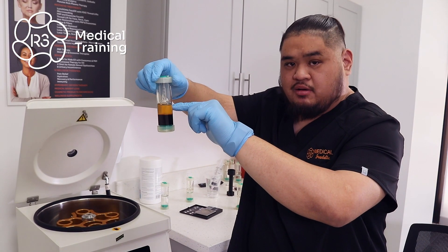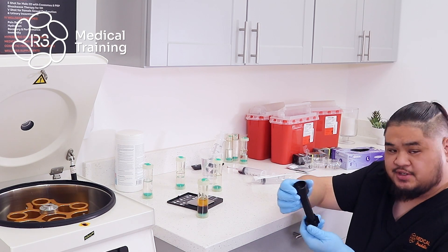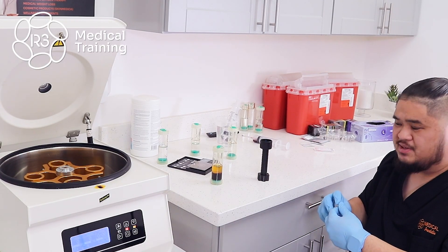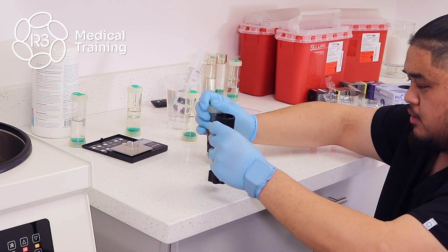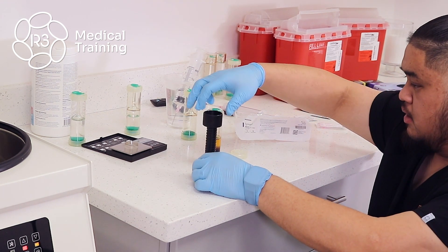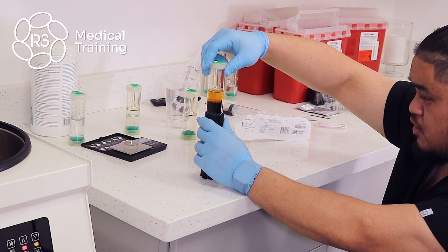What I'll do now is separate the red blood cells from the plasma — I'm going to isolate the plasma and the buffy layer and add it into a clean second syringe to do our second spin to further concentrate PRP. First I'm going to get our screw pusher, which we'll use to push the plasma into a separate syringe. To use the screw pusher, unscrew the cap at the bottom rotating it clockwise, with the base piece all the way at the top ensuring there's no protrusion coming out the middle. Then press the tube down into the tool and rotate it just until you get a little resistance to keep the tube in place.